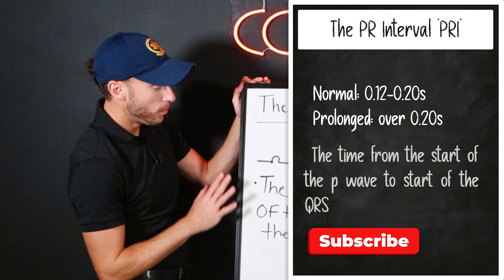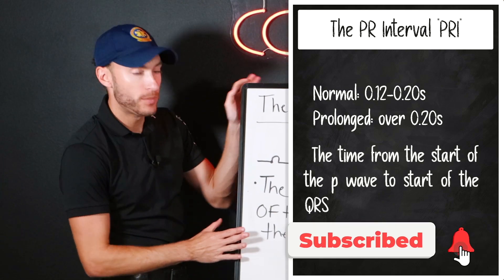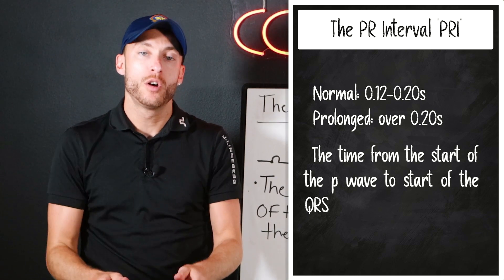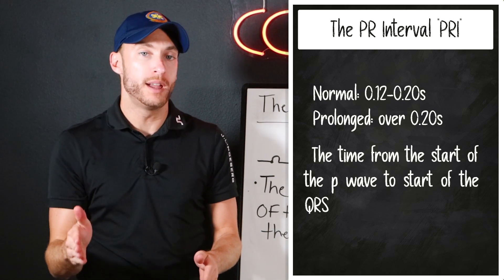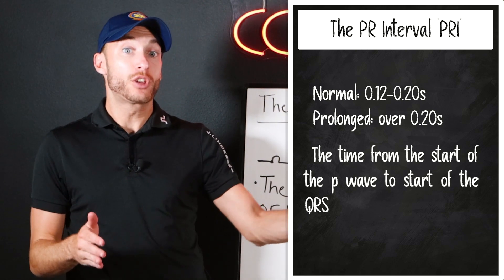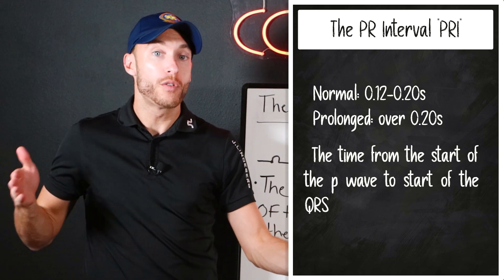Right here we can see, as a reminder, the PR interval is the time frame from the start of the P wave to the beginning of the QRS, meaning the beginning of the Q wave and the start of the P wave.